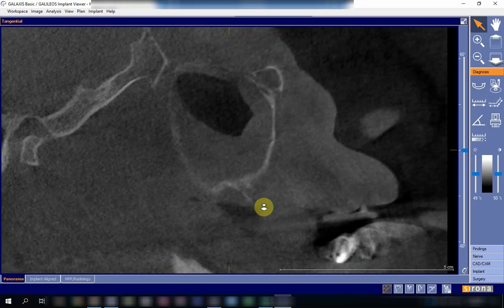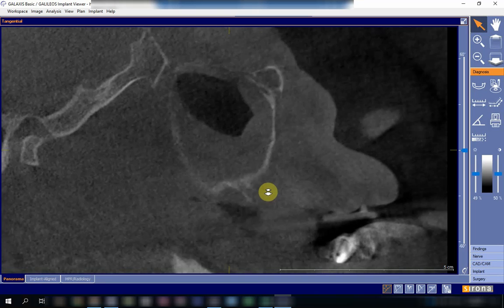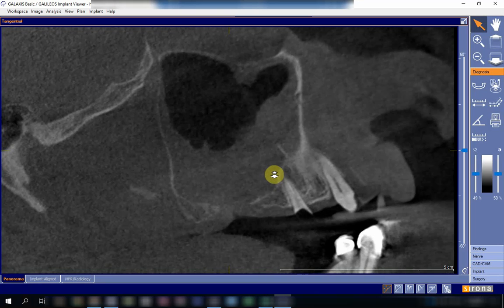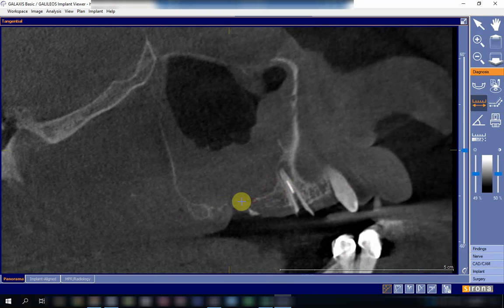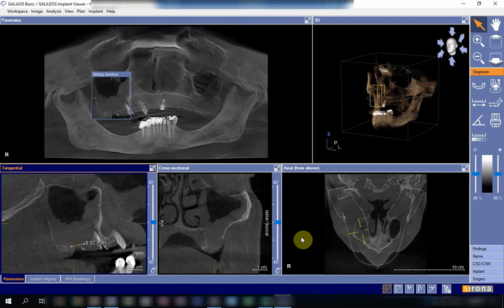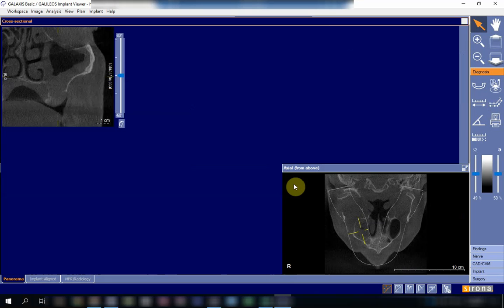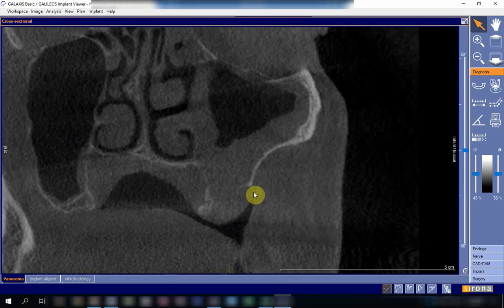In the sagittal view, you can see the oral antral fistula. It is actually quite large — there is a big area of discontinuity measuring around eight millimeters. Now if we look at the coronal view, we will see it again.